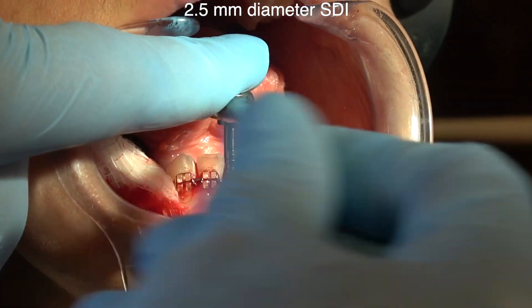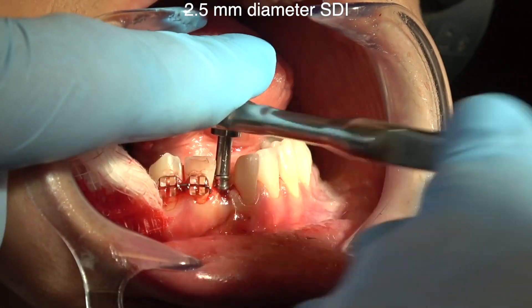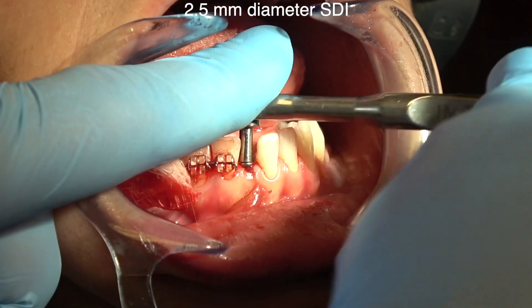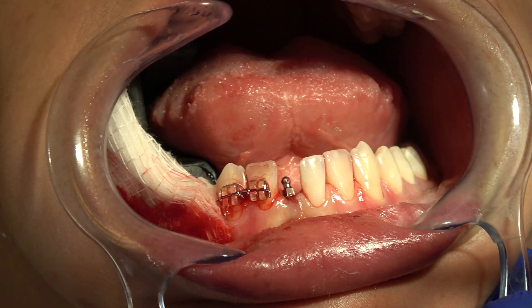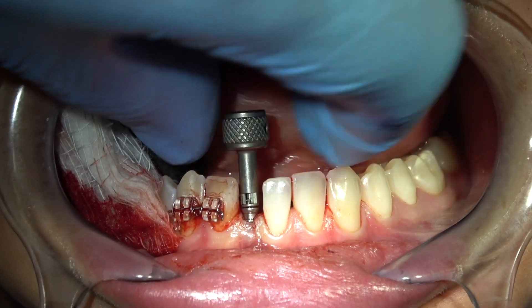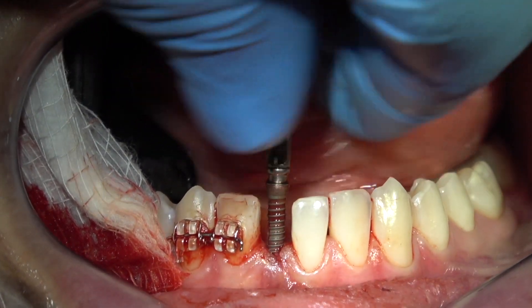Having that implant travel in the perfect direction is also tricky because you don't want to drill into the roots of either of the adjacent teeth, and you don't want the implant to be touching the root of either of the adjacent teeth. And once I place the implant, you'll see how thin the bone is on the facial apical. I decide the angle is not exactly right — I'm going to change the angle just a little bit. As long as you can get implant stability, meaning you can't screw the implant in with the finger driver, then the bone will osseointegrate with the implant.